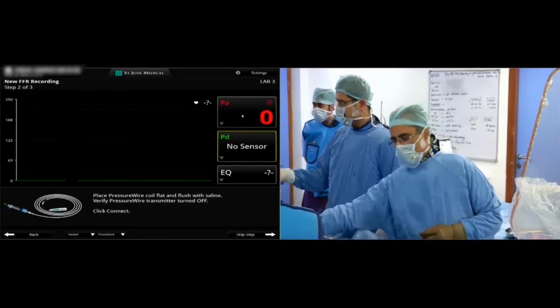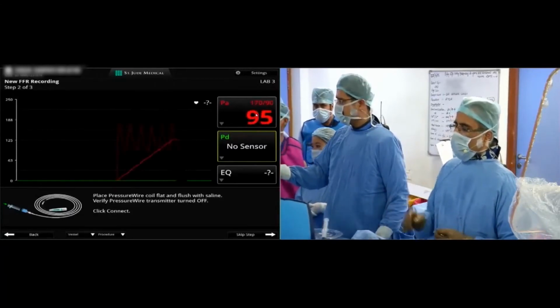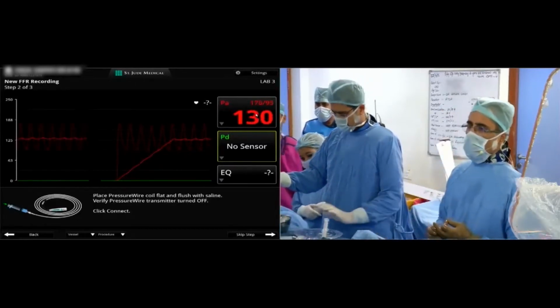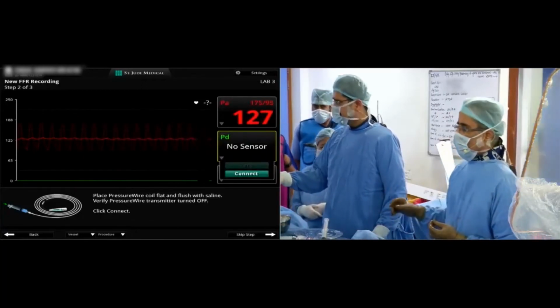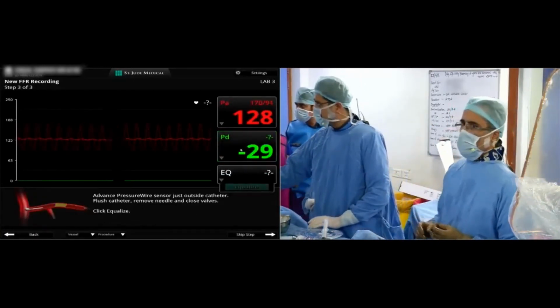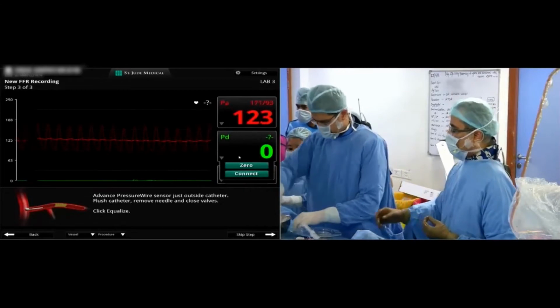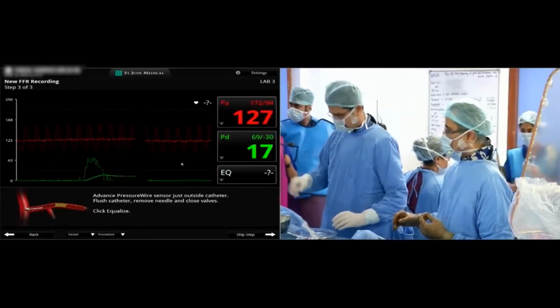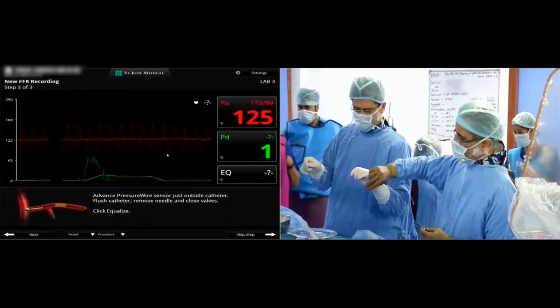Yeah, so I don't know. This discrepancy is commonly seen. What's your experience about it? Normally, 6 millimeter square area lesser than this. Obviously, there was some correlation between abnormal FFR and area in left main especially. But there are situations like this which are pretty unique. Visually, it looks like 30-40%, not more. Area comes out to be 4.9. So let's see the FFR. Even I think that it should be negative. In this case, personally, I would rely on the FFR measurement.